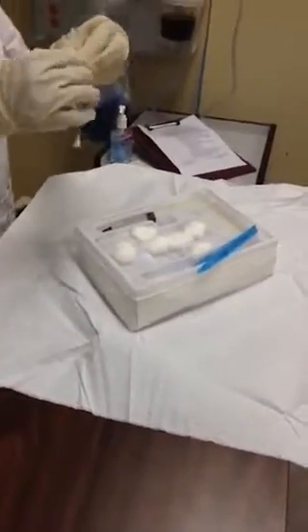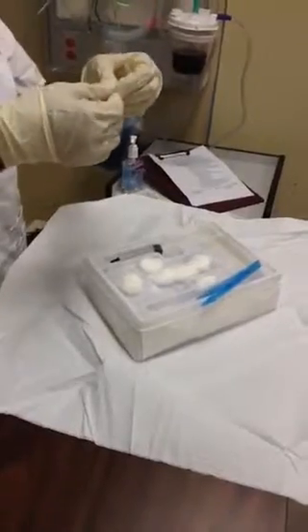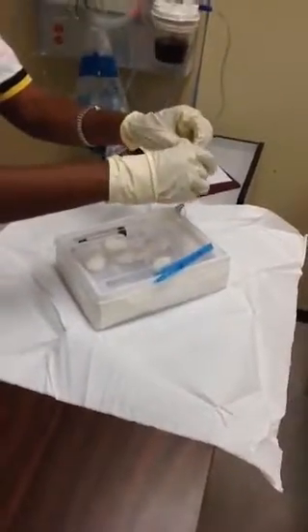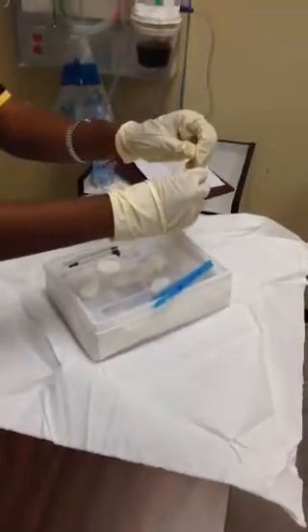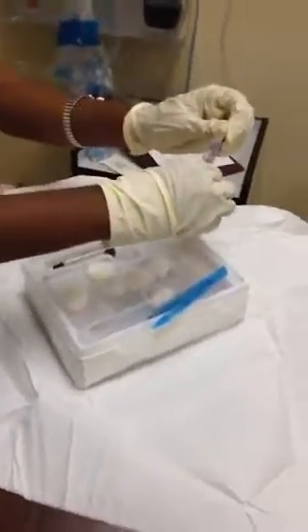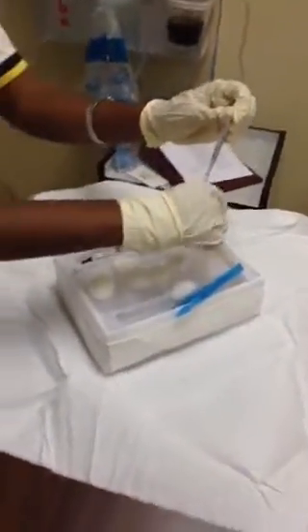Now I'm going to open my lubricant. Put it on this side. Trash it.